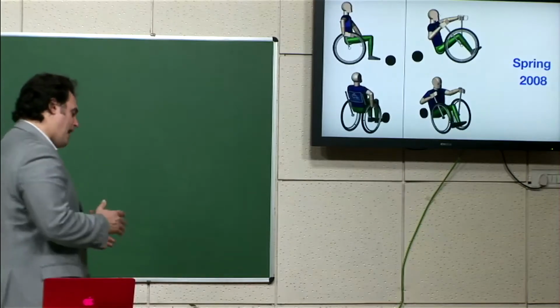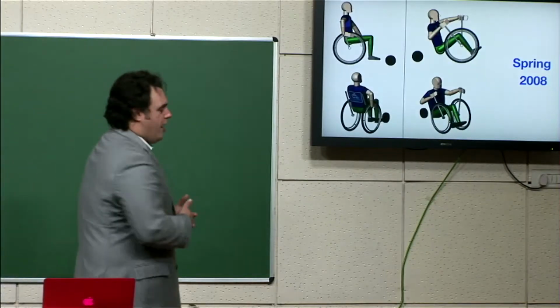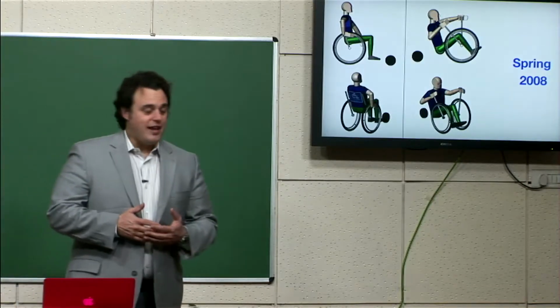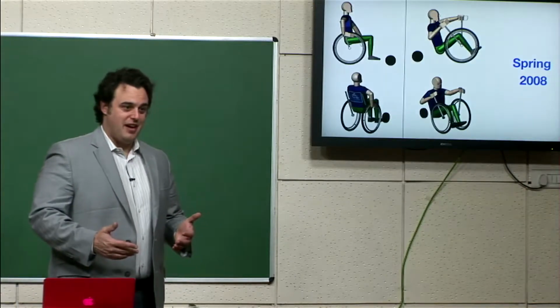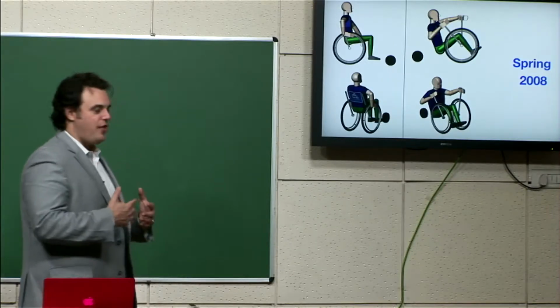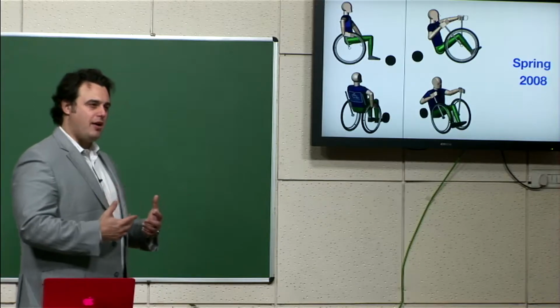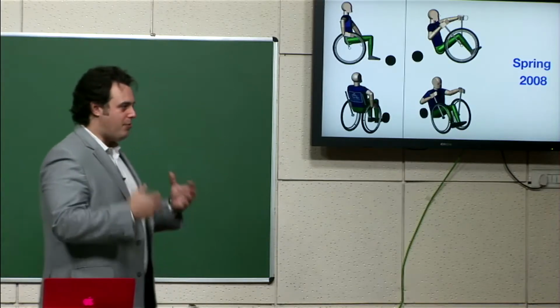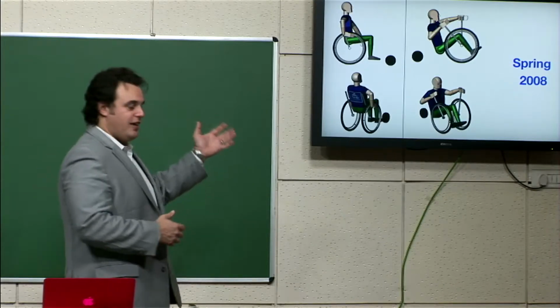So, okay, back to the design process. At this point, this was back in 2008, 11 years ago, we were at the concept phase, using the same vernacular that we were using yesterday. So we had to start thinking about what is a physical embodiment through which we can grab lever ranges and propel this wheelchair. So here's a relatively simple concept.